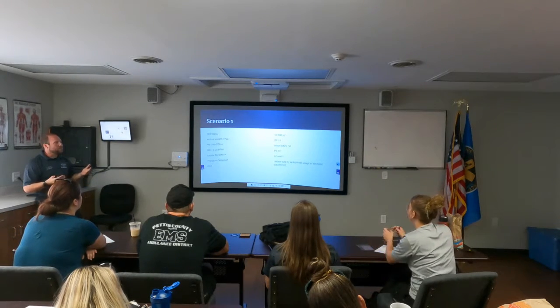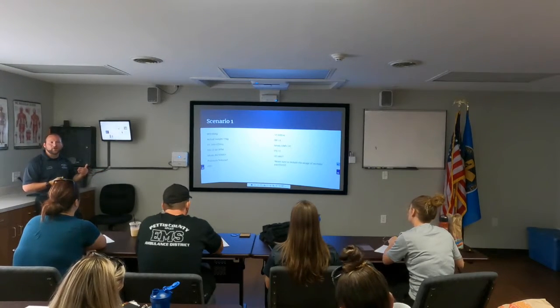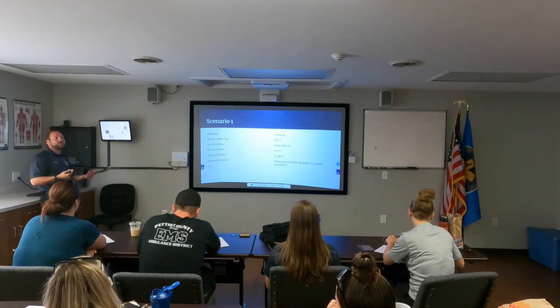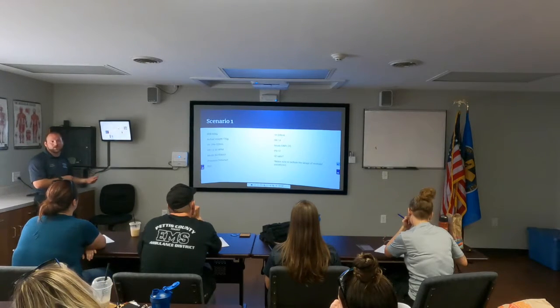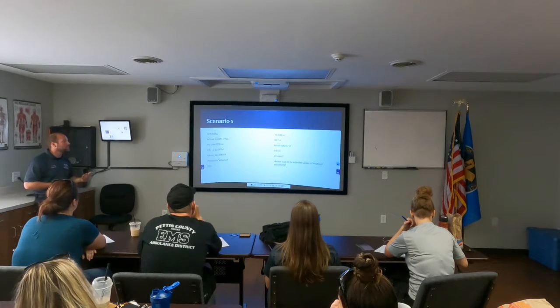Biggest problems that you may run into if you don't have a proper I:E ratio is that breath stacking can happen, or they feel like they are just not able to offload the volume that they get. So you're going to see issues as far as auto-PEEP, breath stacking, where then we start moving to the aspect of barotrauma, the aspect of we're now injuring the lung that we're trying to protect.